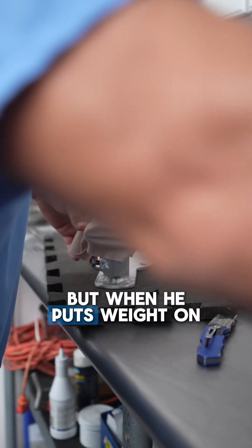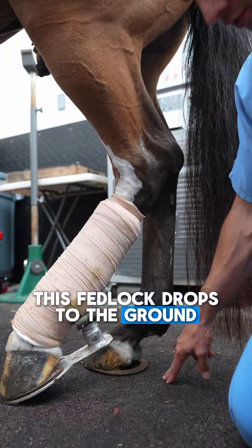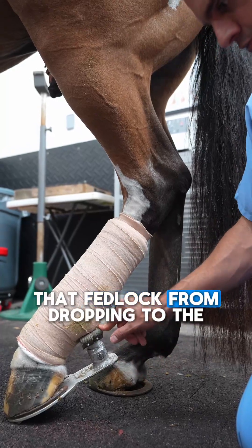Right now he is very painful, and when he puts weight on it, this fetlock drops to the ground a whole lot. So this is helping us prevent that fetlock from dropping to the ground.